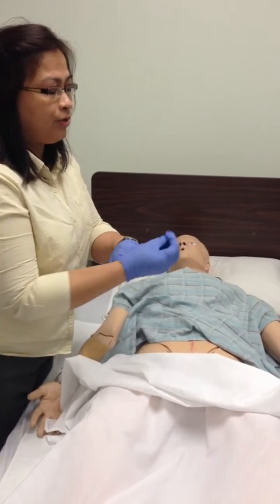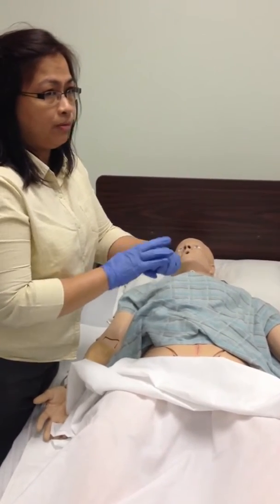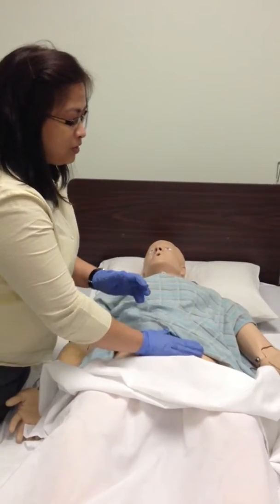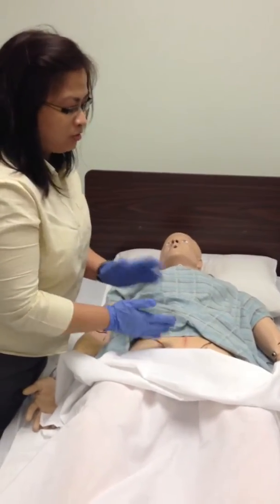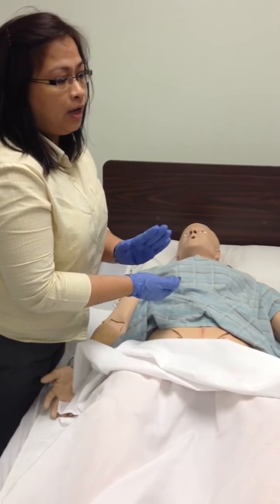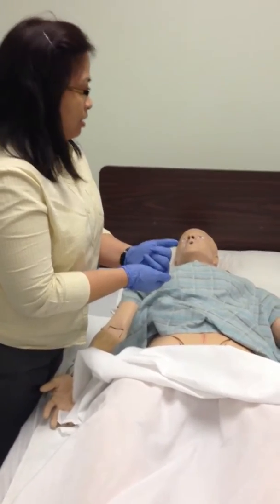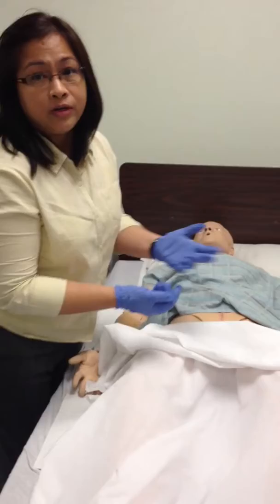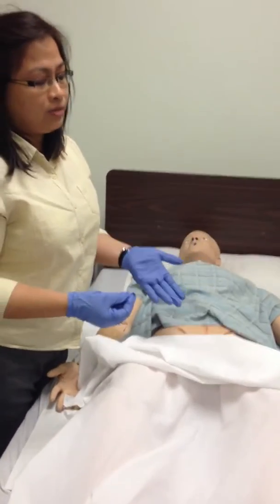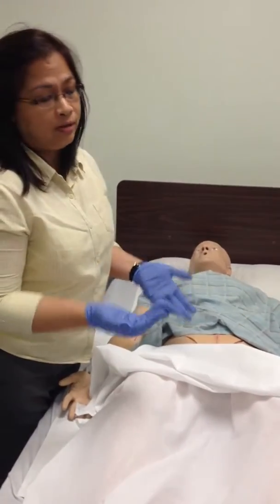And the more urine inside, the harder it is, and the more you can feel the form, right? And what is the reason why we're palpating? Because you just want to check if she's retaining urine inside the bladder. And you are not checking to see if she needs the catheter or not. Distended or not, you need to insert the catheter because there's an order, all right?